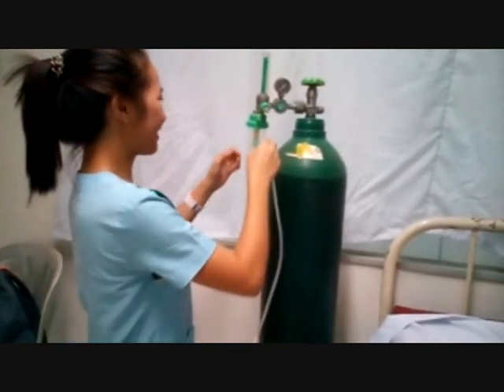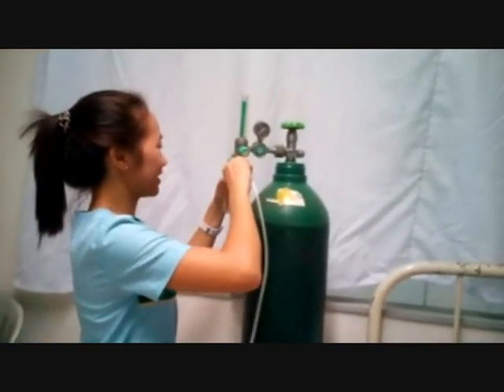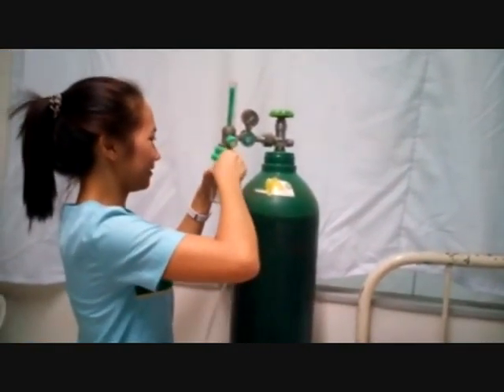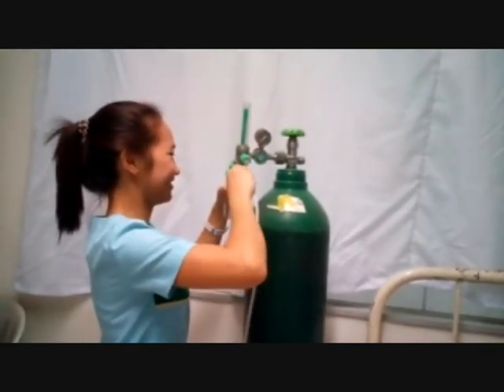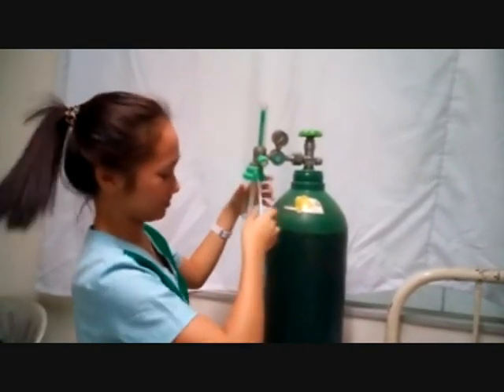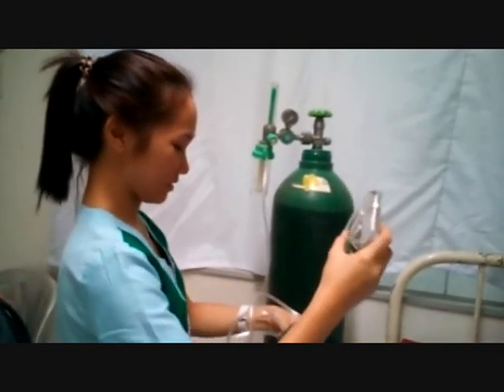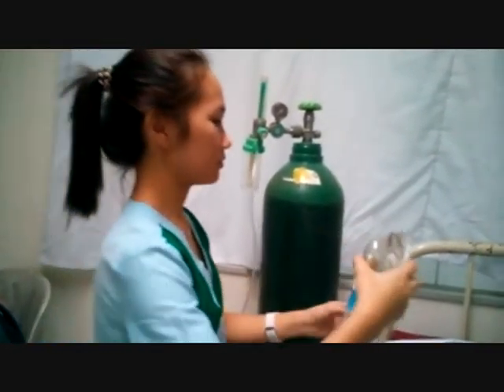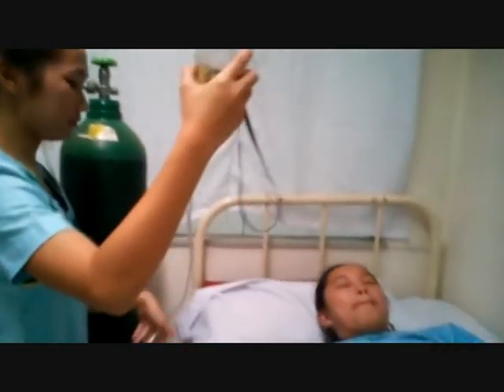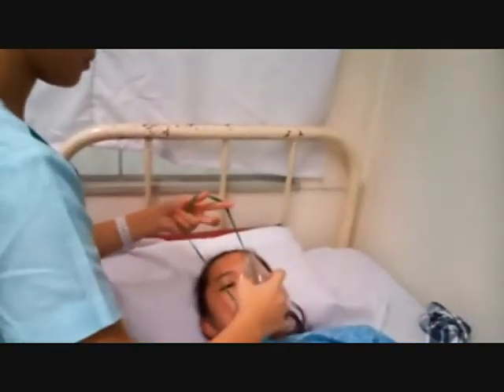Attach face mask to oxygen source with humidification if appropriate for the specific mask. Start the flow of oxygen at the specified rate. For a mask with a reservoir, be sure to allow oxygen to fill the bag before proceeding to the next step.